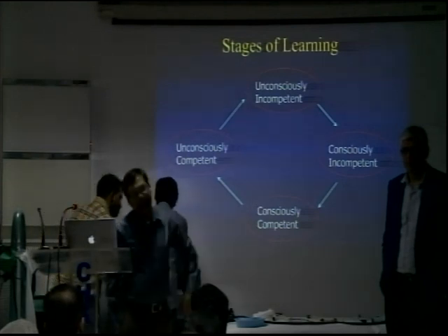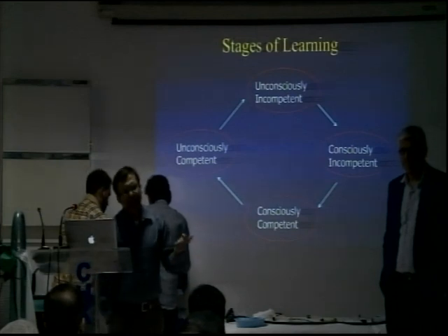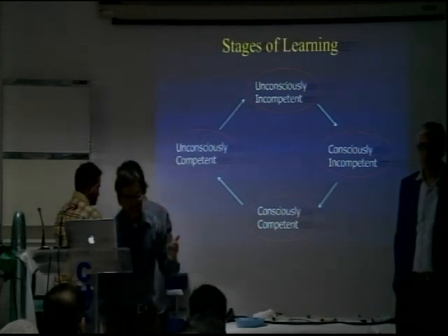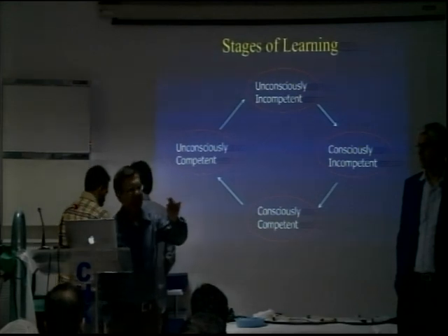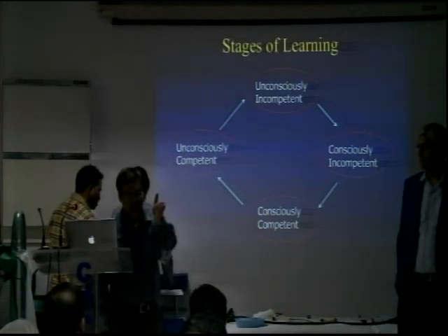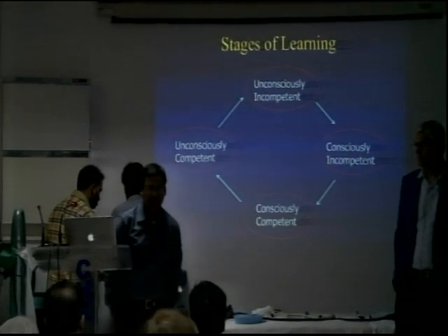Then there is a term called the fistulotomy. Usually in bile duct cancer or pancreatic cancer, it's hard to get through the papilla. Then you select a space above the papilla and, using your needle knife, you try to get into the bile duct blindly. Again, not a good idea.